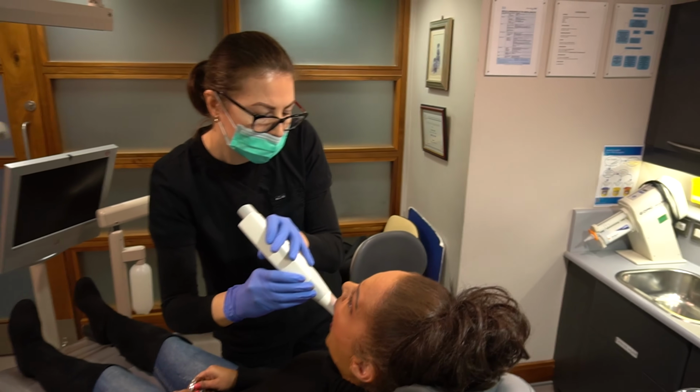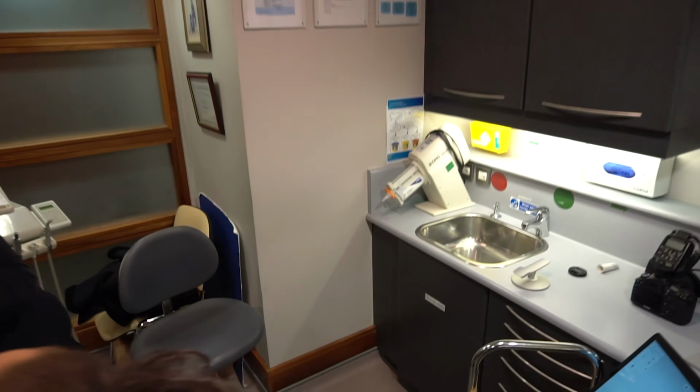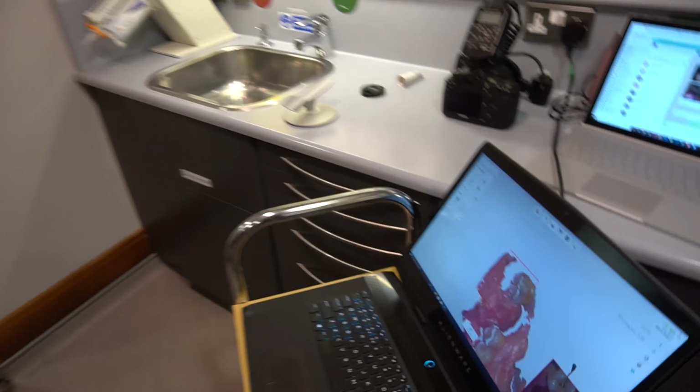The second is an impression or a digital scan. And I've got no preference. We get the same results whether we take a digital scan or an impression. Typically, we have one scanner between the different rooms, so it may be in use, or there may be technical issues. These are issues you never get with a classic impression.